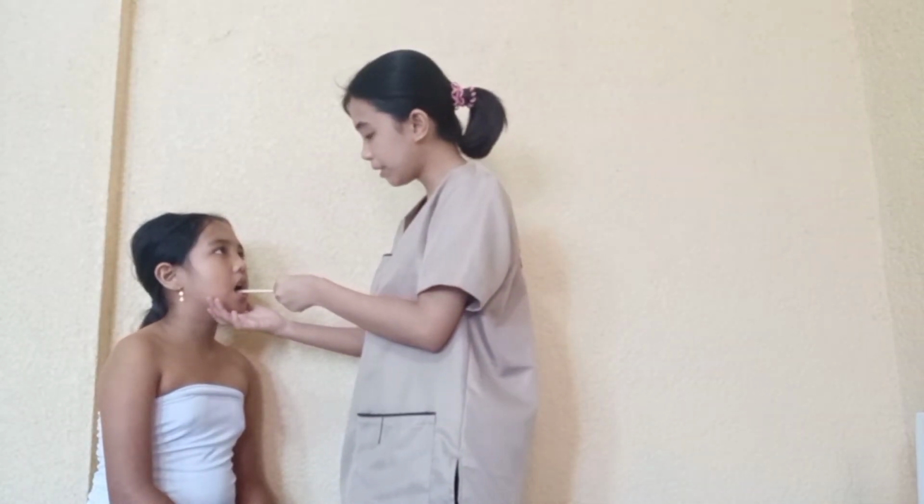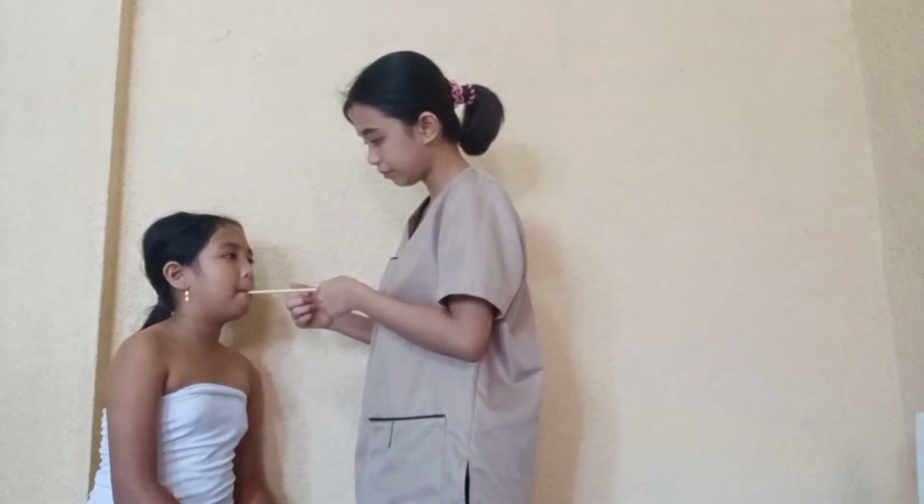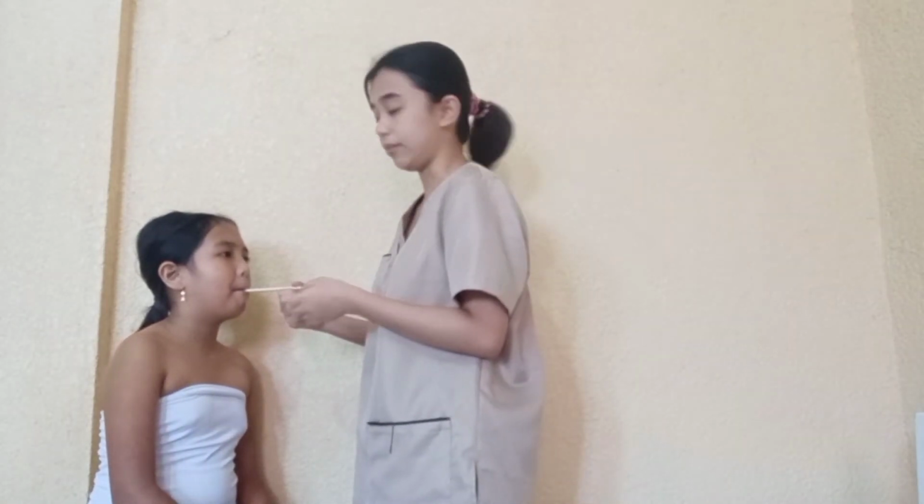Okay, next I'm going to ask the client to close his or her lips around the probe. Ma'am, can you please close your lips? Okay, next I'm going to continue to hold the probe until I hear the beep. After that I'm going to note the temperature reading. Okay, ma'am, thank you.